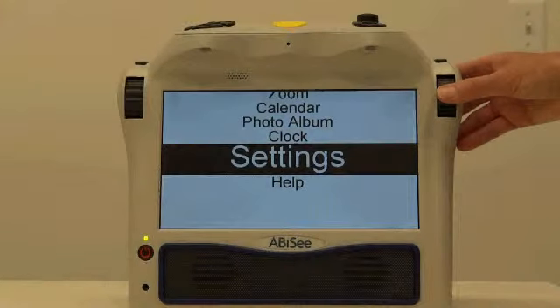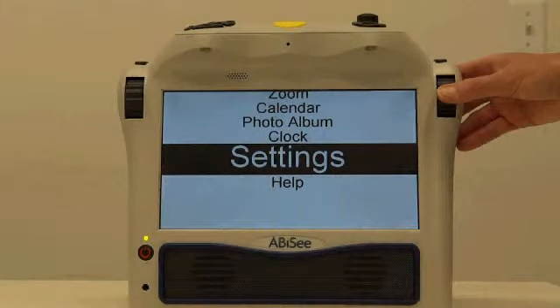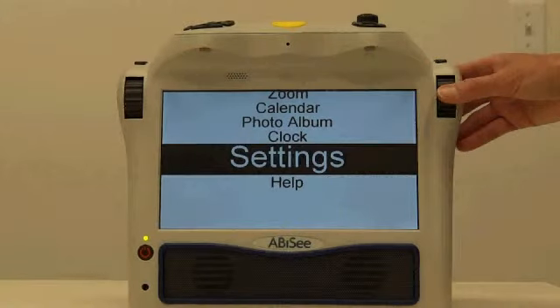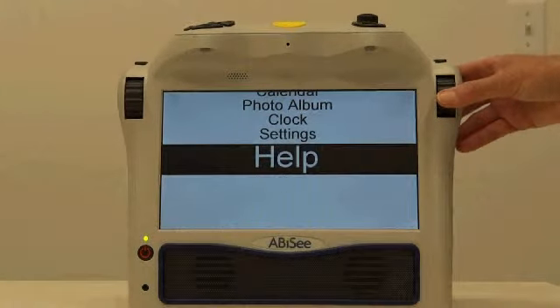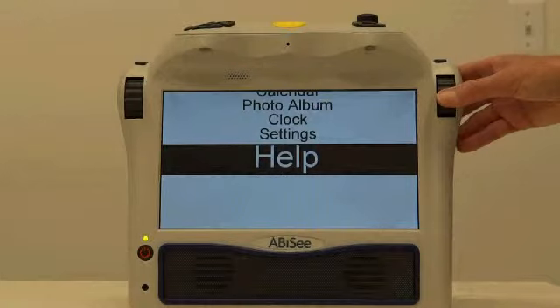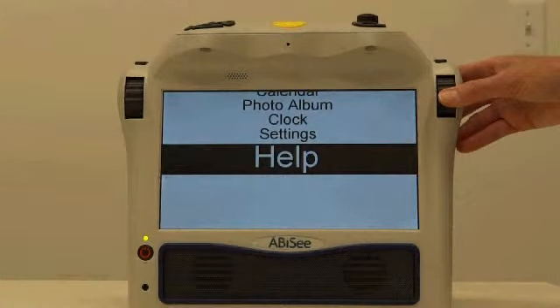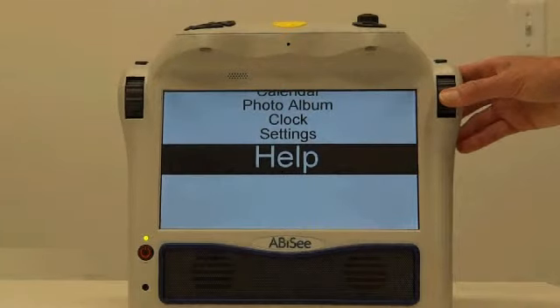Settings. The Settings option allows you to customize your device according to your own preferences. Help. The Help option allows you to hear the detailed descriptions of each button, its functionality, and how to use each function.